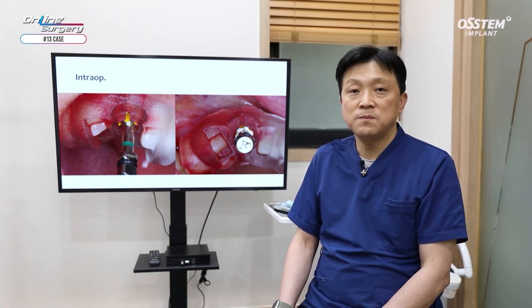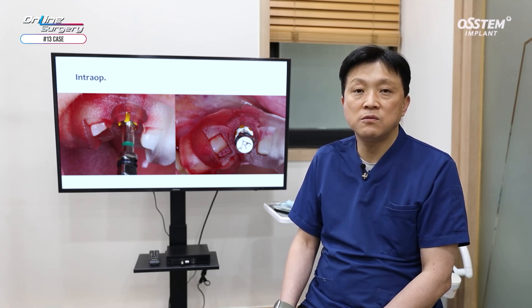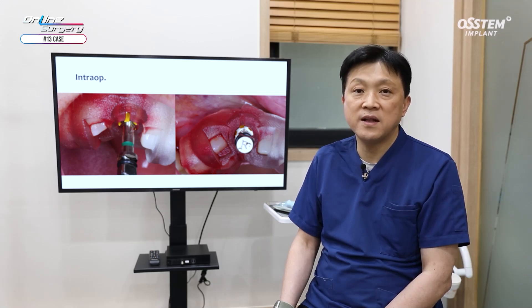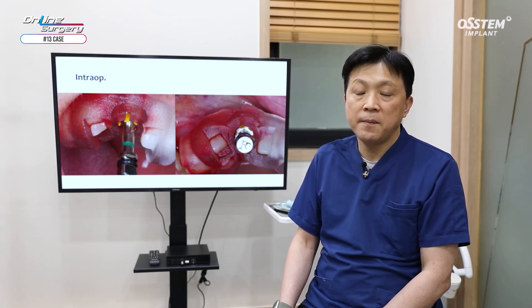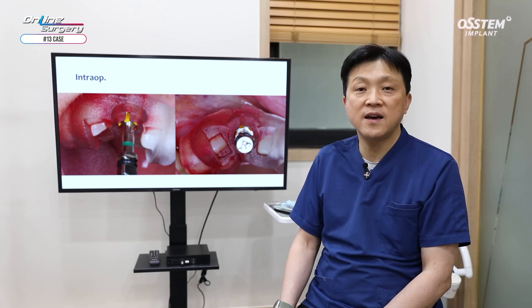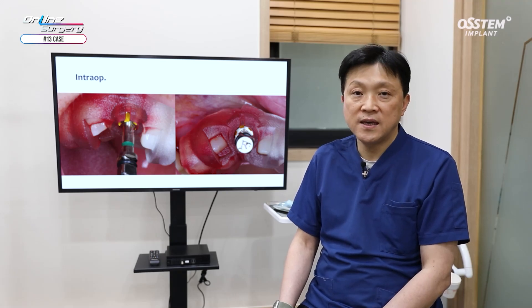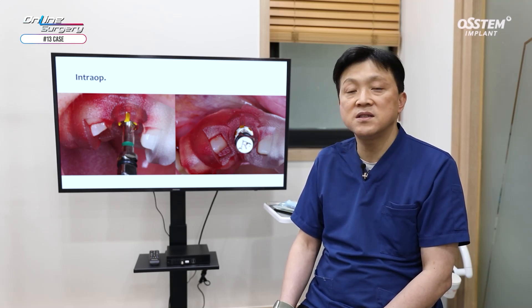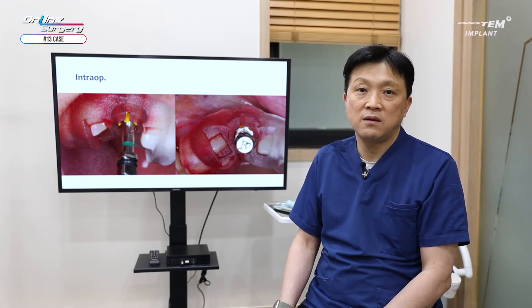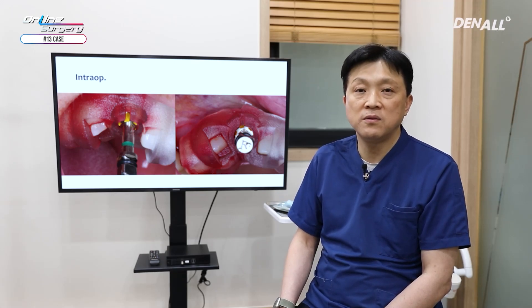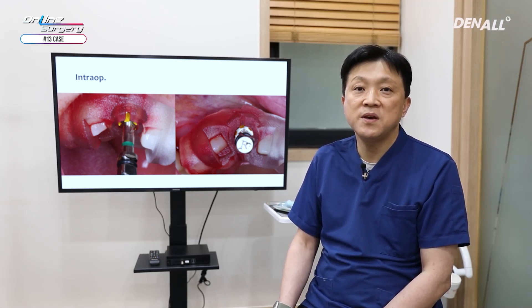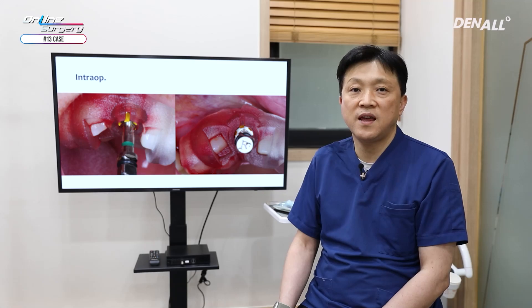The reason is that in the case of upper anterior teeth, after extraction, we need to drill on the inclined surface of the palatal slope. In order to prevent drill deviation, we need to use a path drill. This is especially helpful in avoiding drill deviation. That was how the implant was placed.